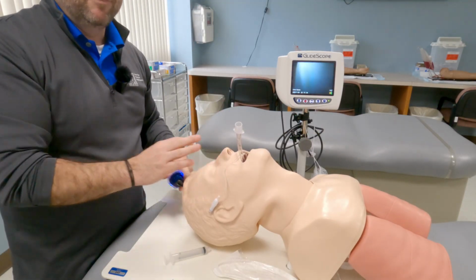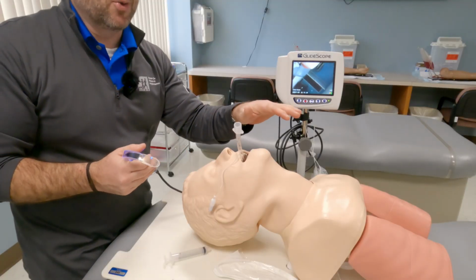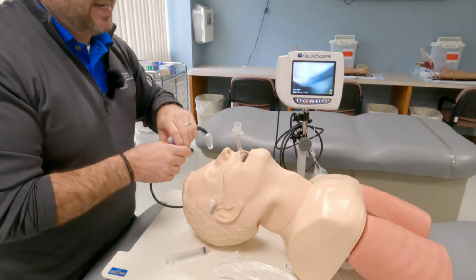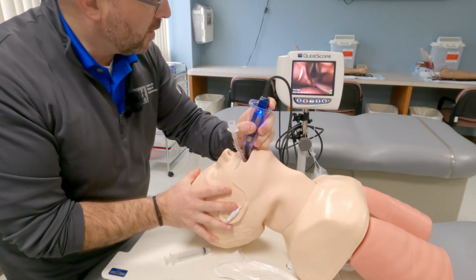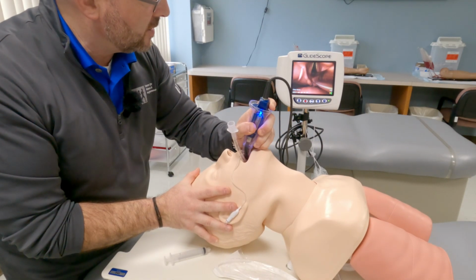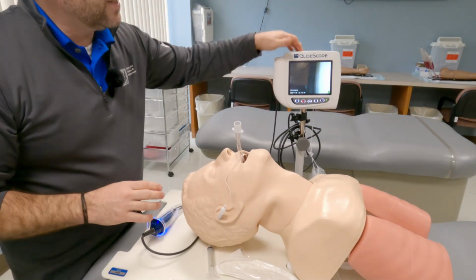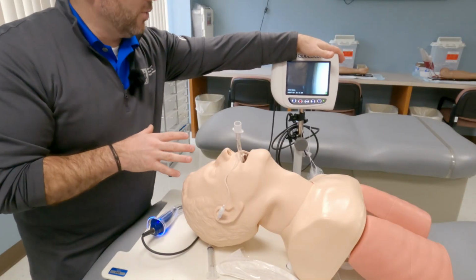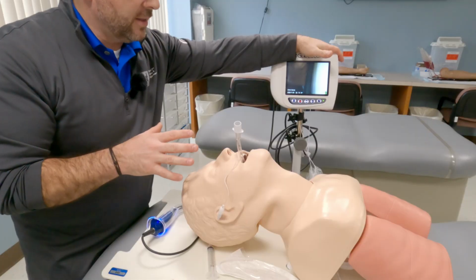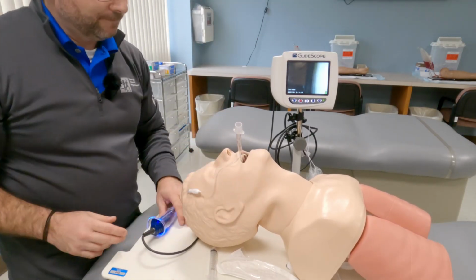Verifying tube placement. That is actually number one way to verify tube placement is watching it go through the cords. Now everybody can actually see that it's gone into the cords. So you can see right there, down into the trachea, we are good to go. And now you shut the monitor off. This has the ability to video if you have any difficult airway or you want to use it for teaching or anything on those lines. But now our endotracheal tube's in and we can ventilate through it.